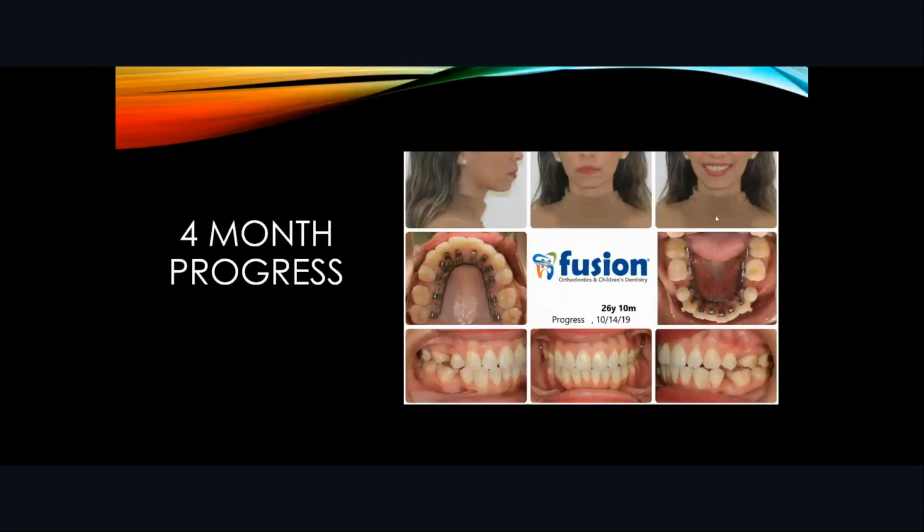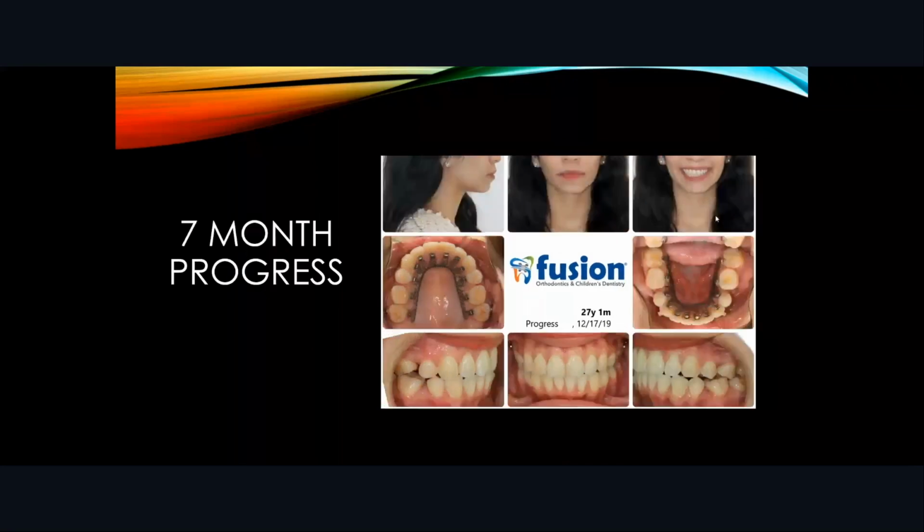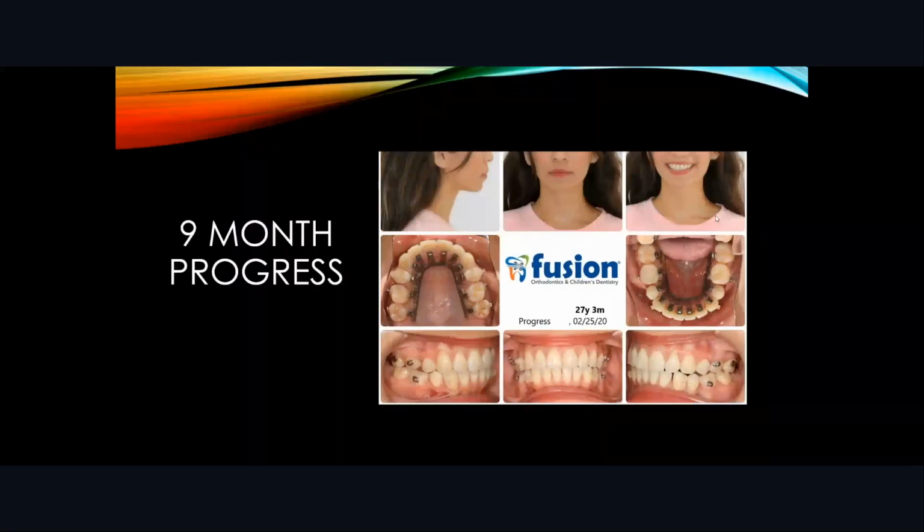This is 4 month progress. The spaces are closing and the crowding in the front is appearing less and less. This is 6 month progress, 7 months, and spaces are closing properly. I'm adding attachments to control the vertical, control the sagittal as a fine fit. The goal is to achieve the most efficient treatment possible, whatever helps to improve the treatment efficiency. There's no problem with doing that.